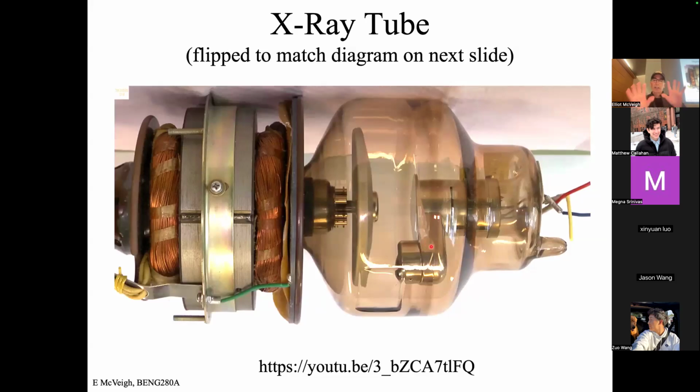So here, this is more like the graphic I'm going to show you. Anode, big motor to spin that anode fast. Here's the electron source. I've got wires going in here providing current, right? And we've got a big voltage between this and this cathode. This is inside a vacuum so that the electrons don't heat up the gas or vaporize it or whatever.